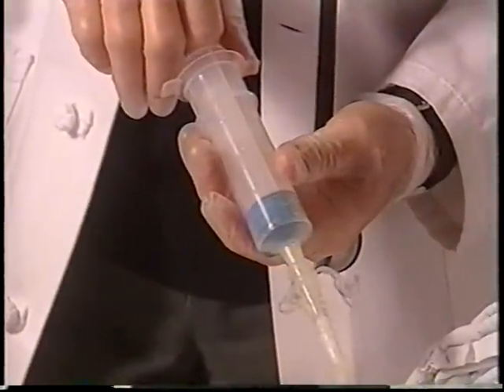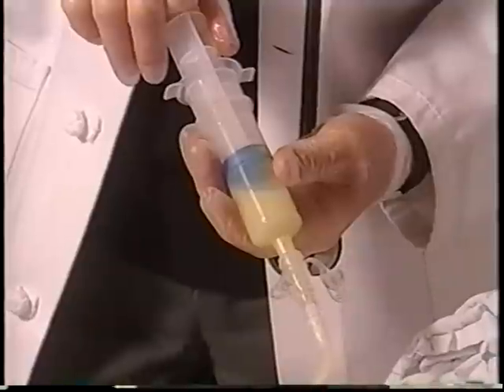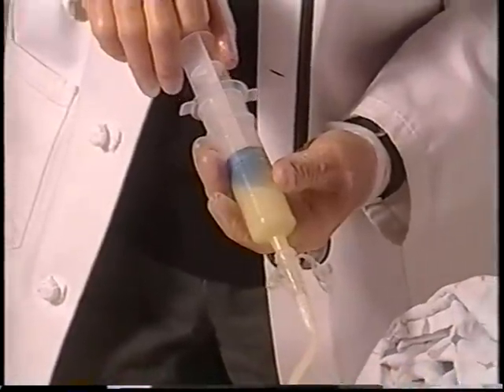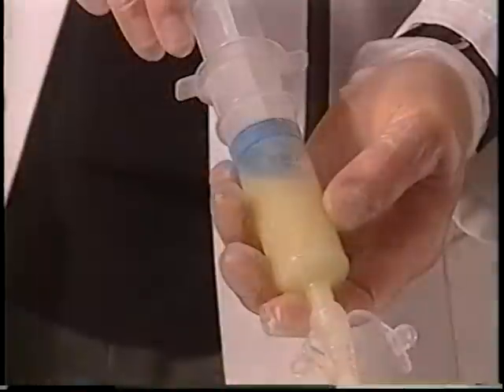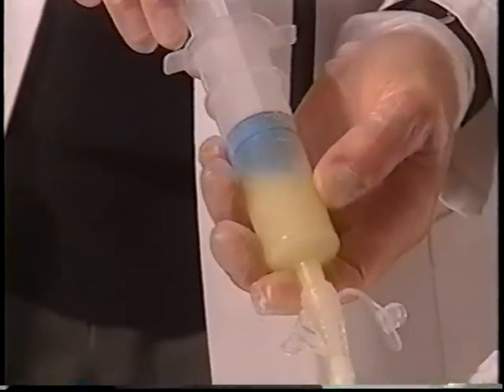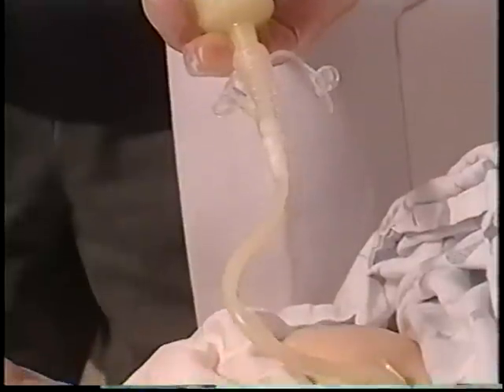After the bubbling sound is heard, stomach contents should be gently aspirated into the syringe to check the amount of residual. The amount of residual is compared to the guidelines set by the physician. If the amount conforms to the guidelines, it is re-injected and the tubing flushed with water. The feeding can then be administered.